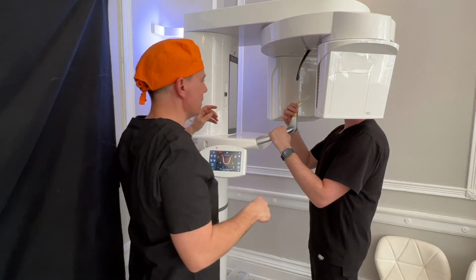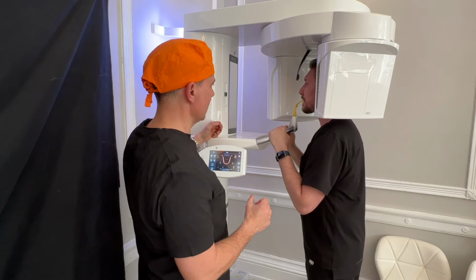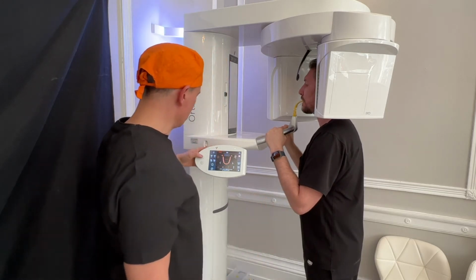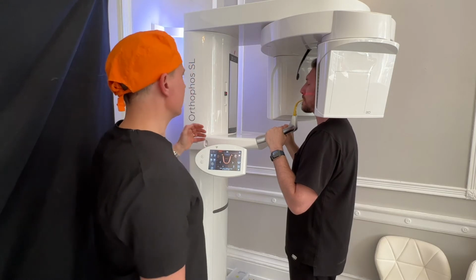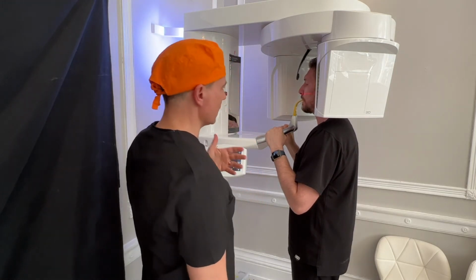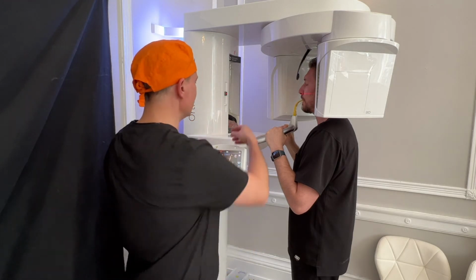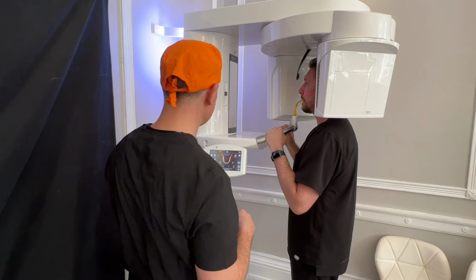And then we ask the patient to just bite into the little groove there, and keep your teeth just behind that notch. If you step in with small steps there, adults, you're standing straight and tall, and we'll turn the light on. You can see here, if we flip the mirror over, that we can easily line the patient up, and they tend to do that themselves really if you say to them, you want that line right across the middle of your face.